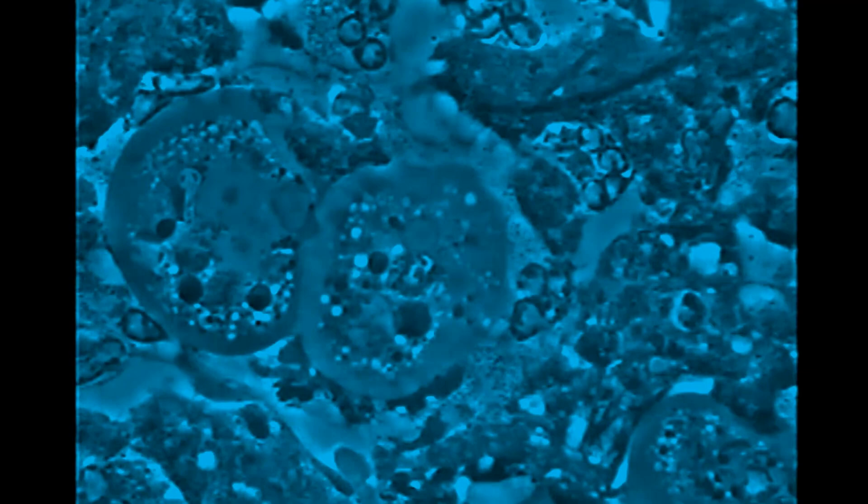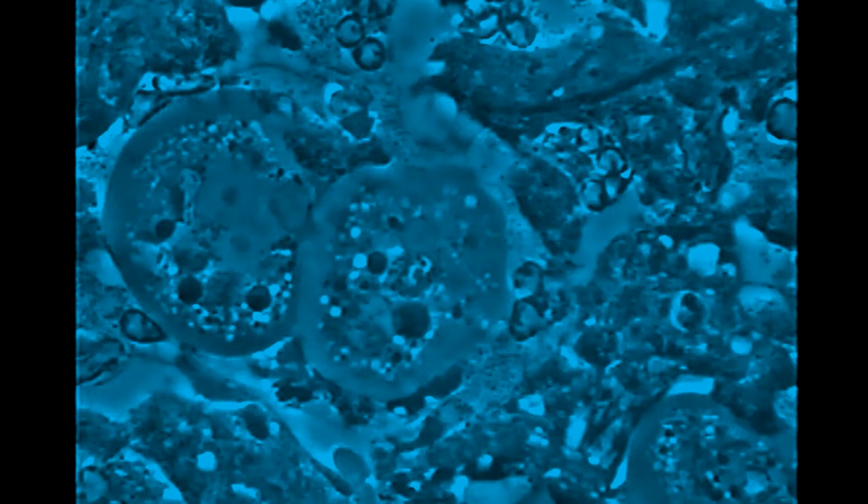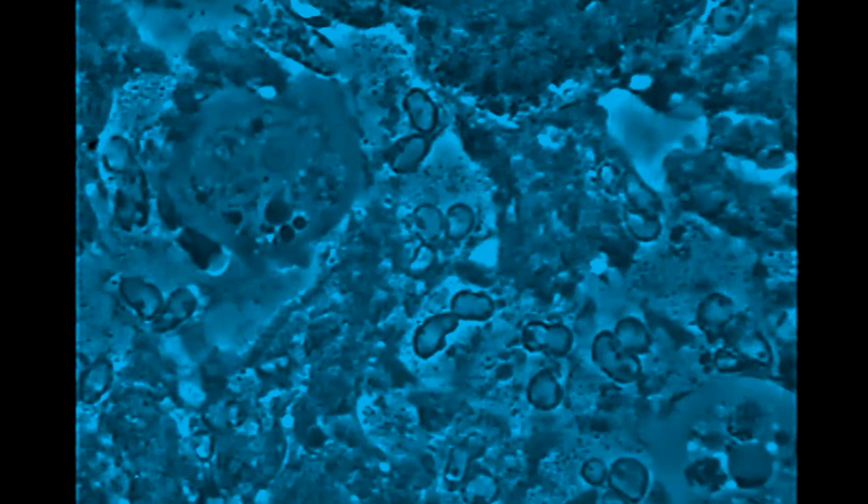So it's some kind of pus, some bacteria but not that many, many neutrophil. Here we've seen an amoeba in the center again. And this is typical of very deep periodontal pocket. So amoebiasis is what we can see and oral amoebiasis during periodontitis is very strong importance.